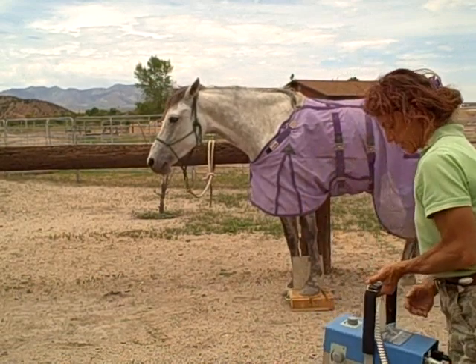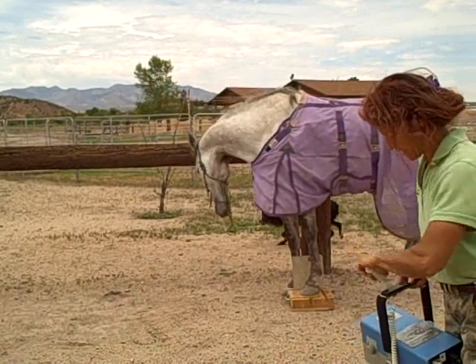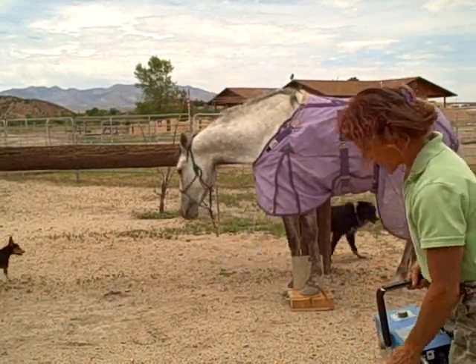I'm sure you've taken a ton of X-rays. I just know all of them are different on how far you need to be from the plate.